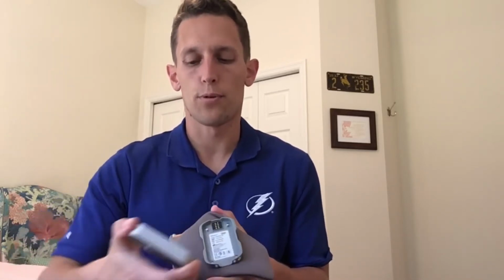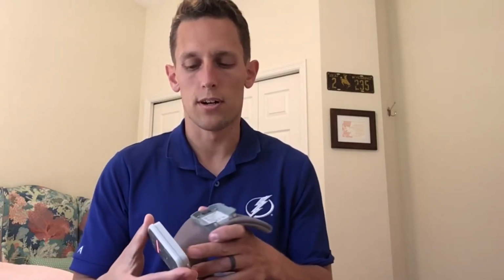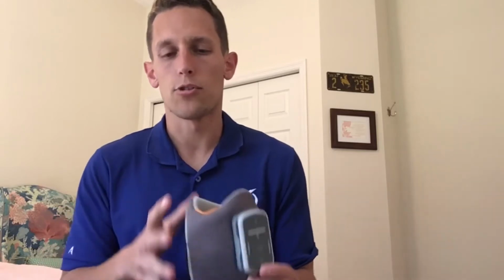Another reason why that may happen with an open electrode fault like that is that this EPG has gotten slightly loose. So there's four pins in the back there. You wanna just make sure all four contact points on here are firmly put in, so you can just unplug it like I just did and you place it right back into its cradle. After that, you should be able to just hit any button and then you should be able to retest, and that should be resolved if that was the only other possible error for that electrode fault.